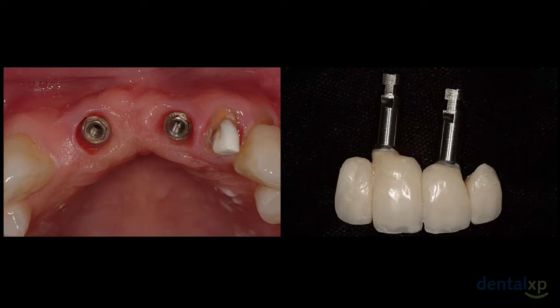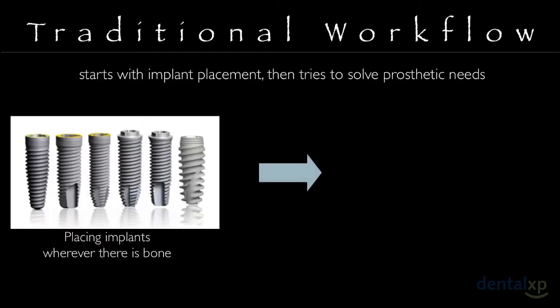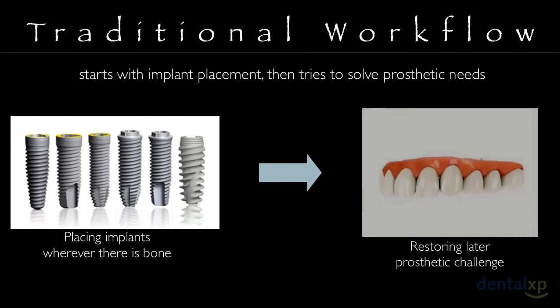In fact, when we asked our surgical colleagues why were the implants placed in these positions, truly the response is, well, it's where the bone is. Well, based upon traditional workflows, it is where the bone is.